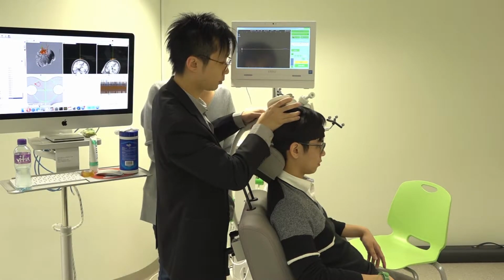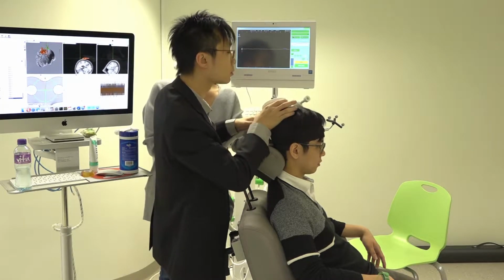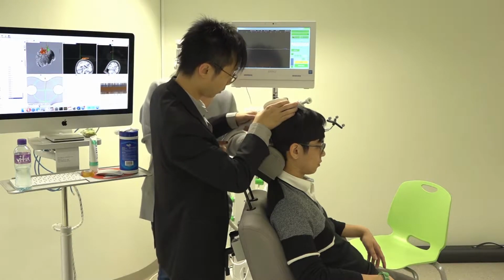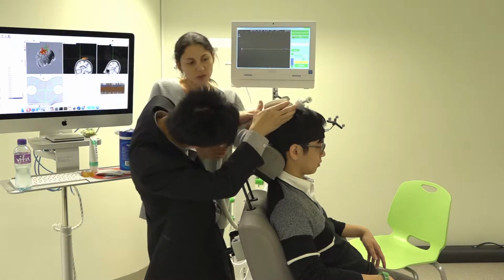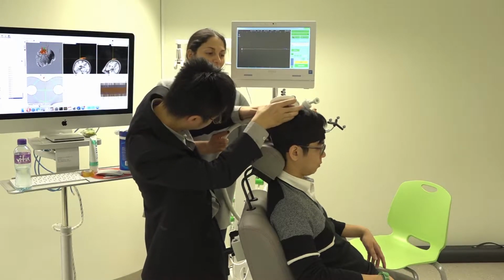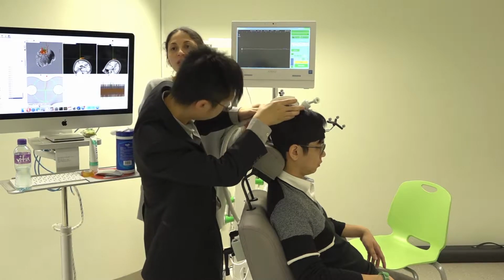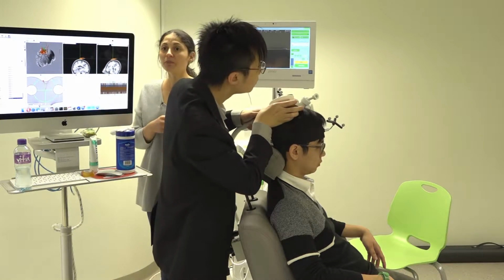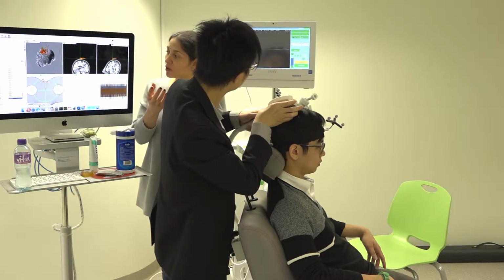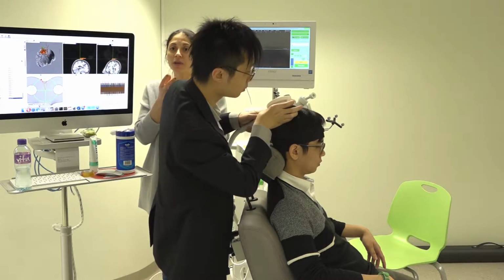You are far from the region, according to the navigator. To back, you are not stimulating. You have so much hair you cannot see. Just play with it. So you see, the idea is that you bring a partner and you play with it, and then you get familiar with holding the coil and how to find the hotspot.